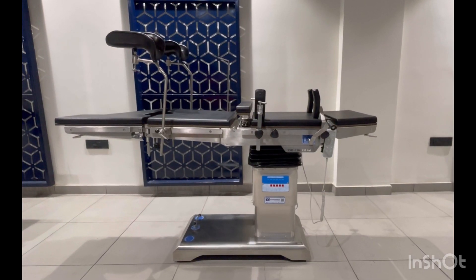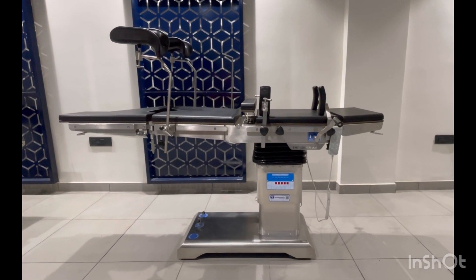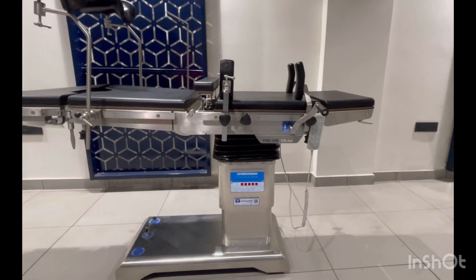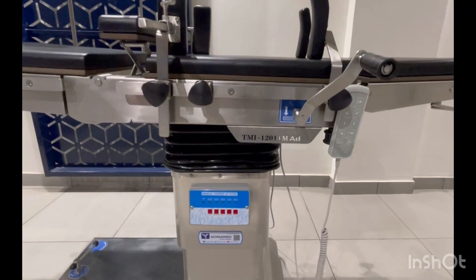Hello everyone, we at Koinam and India Pevent Ltd are going to introduce our new model, the TMI 1201 Advanced Electric Plus Manual.